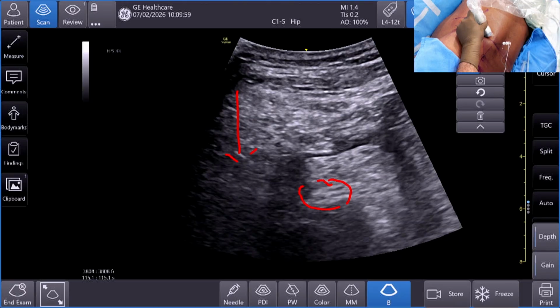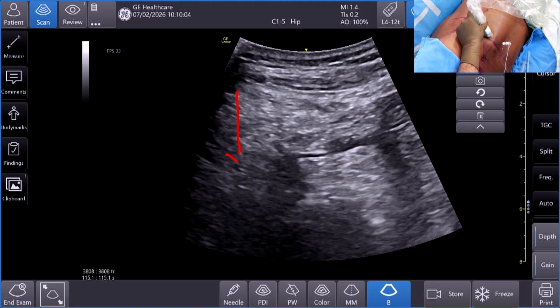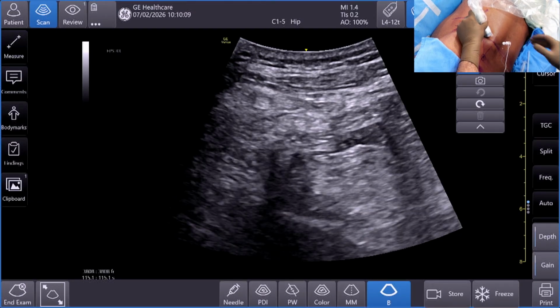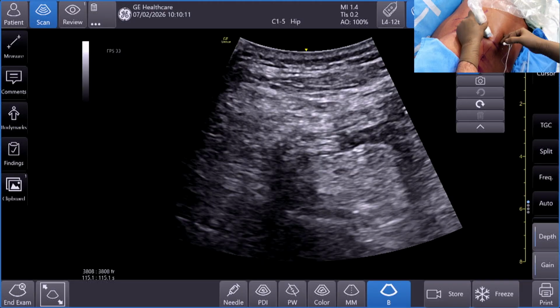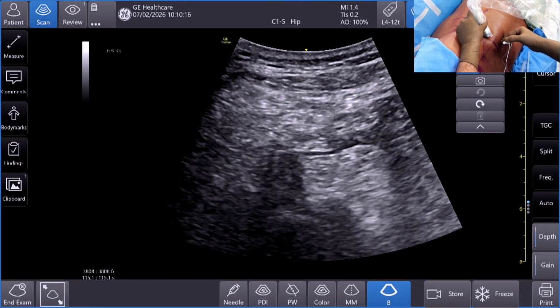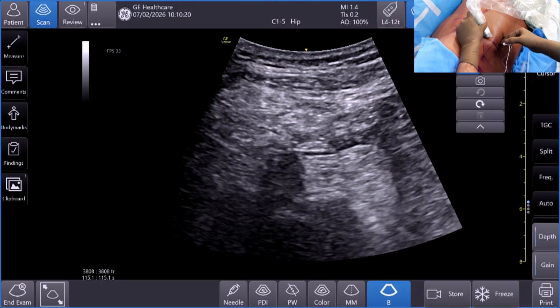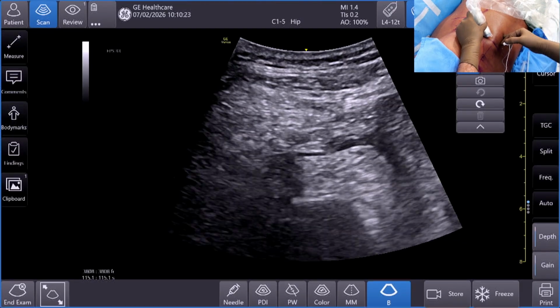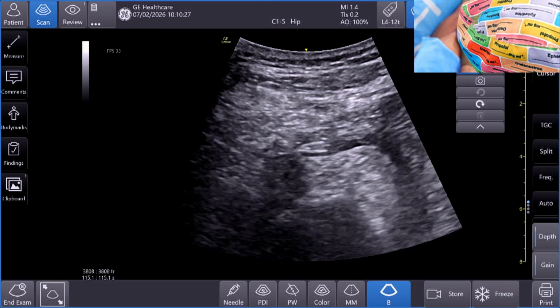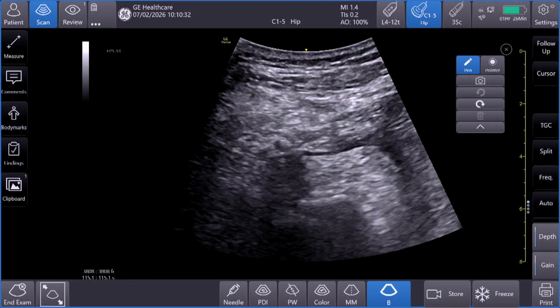Now what happens is, as you rightly pointed out, we require the withdrawal of this needle. So I'm just trying to jiggle it. Probably it's very close also to the intervertebral foramen, and I think there could be some epidural spread. This is the needle. Okay, can you increase the current? So everyone can appreciate the needle.